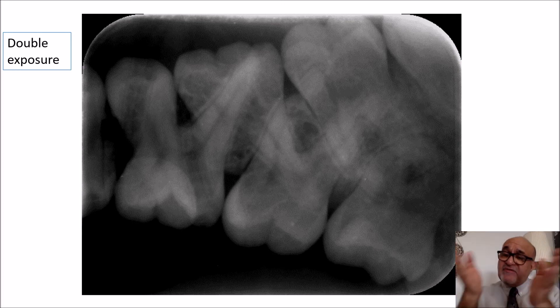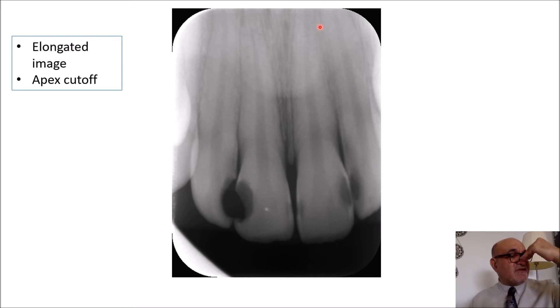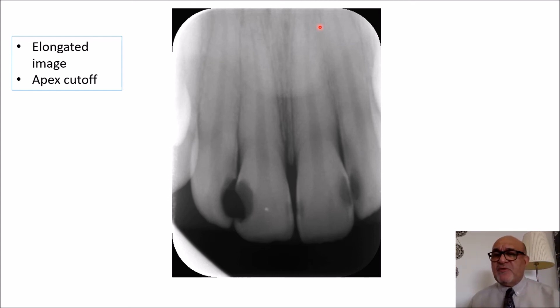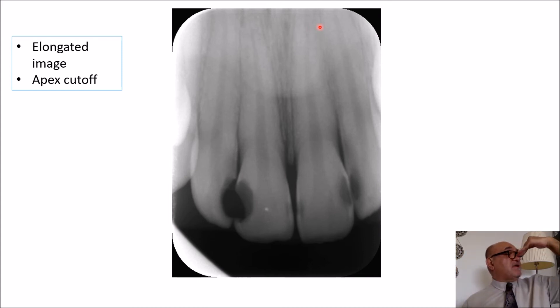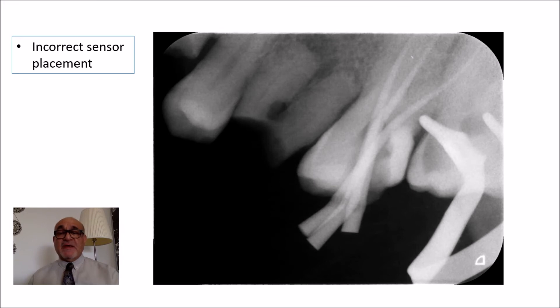An elongated image like this one with apex cutoff is useless. What happened here is that the vertical angulation was decreased, resulting in an elongated image. Next time, you need to increase your vertical angulation so that the image will be reduced. Otherwise you will end up with this case where the apex is cut off and the radiograph is useless.